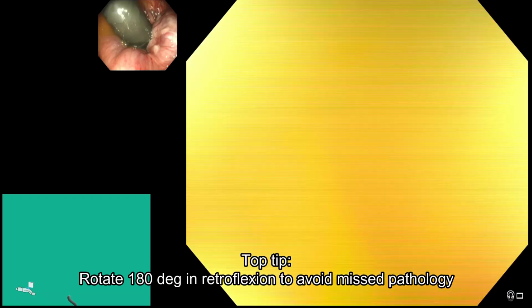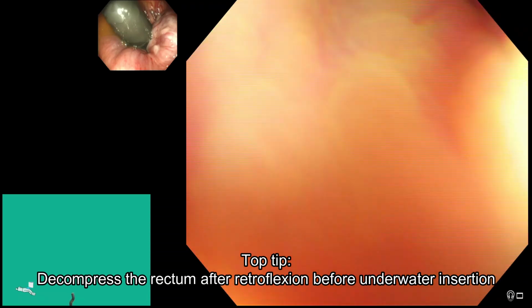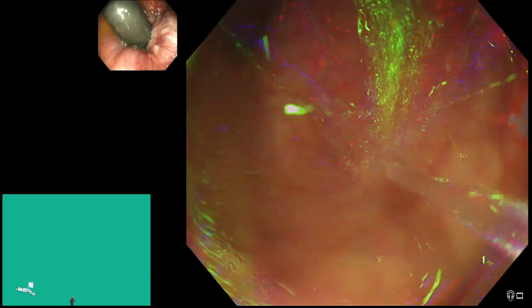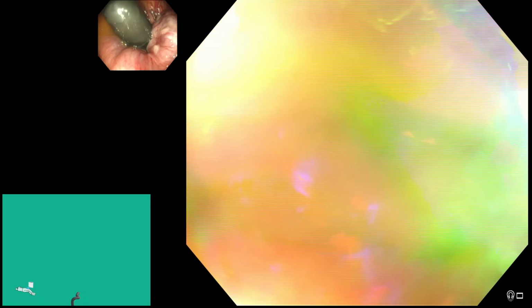We then decompress the rectum so you lose luminal view, and then my foot goes on the pedal for the water jet. Essentially views are a little bit more difficult in this sort of situation, particularly if the bowel prep's a little bit murky, and so what you just have to do is, it just takes a little bit of practice to get your eye in.